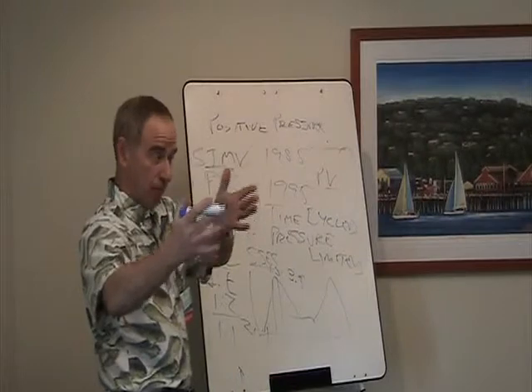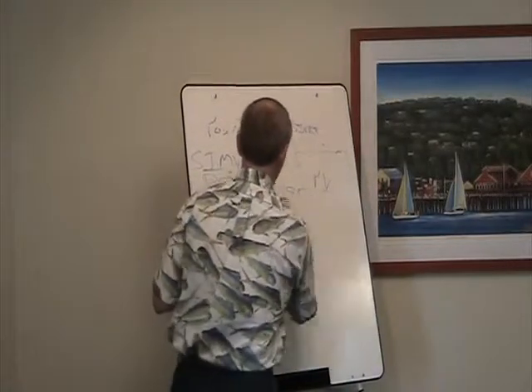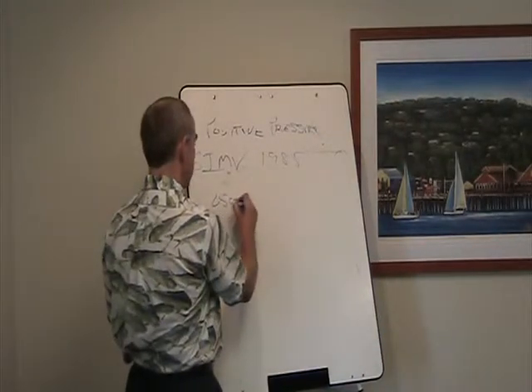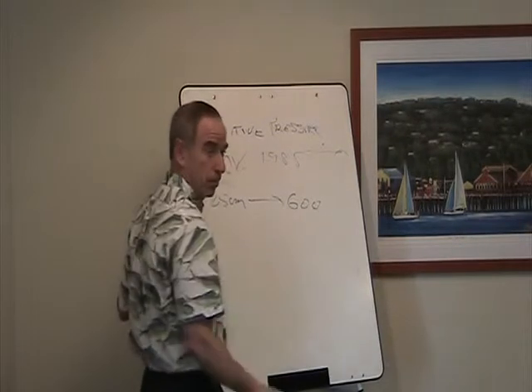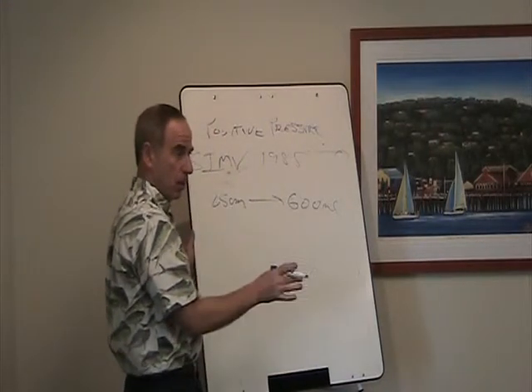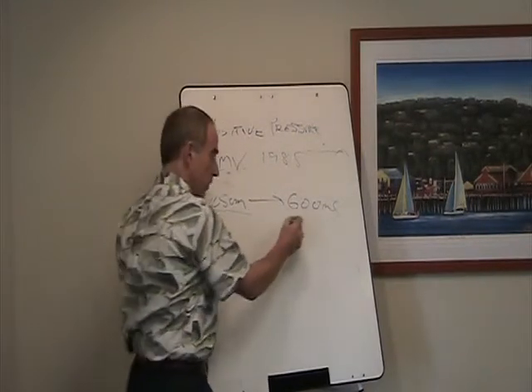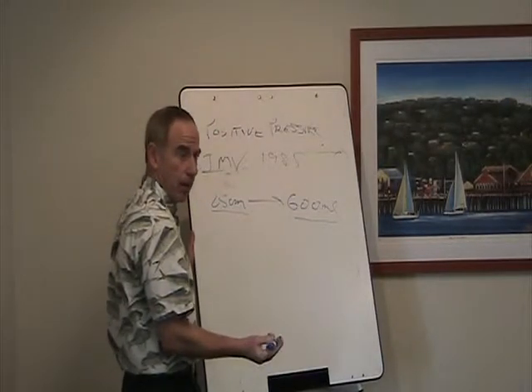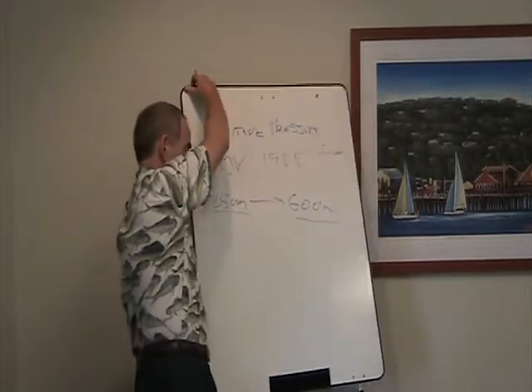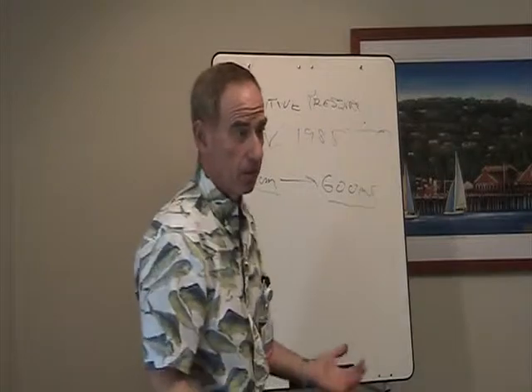Conversely, if I give that same volume, say you're supplying a pressure of 25 centimeters, and that's generating a 600 cc tidal volume, right? And nothing changes. Everything's static, compliance is the same, resistance is the same. We're doing this from one minute to the next minute. Nothing is changing, okay? Every time you give 25 centimeters, in theory, you should get about 600 cc tidal volume, correct? Conversely, if I give a 600 milliliter tidal volume, how much pressure should it take to generate that? 25 centimeters, right? They should be the same, they should be equivalent.